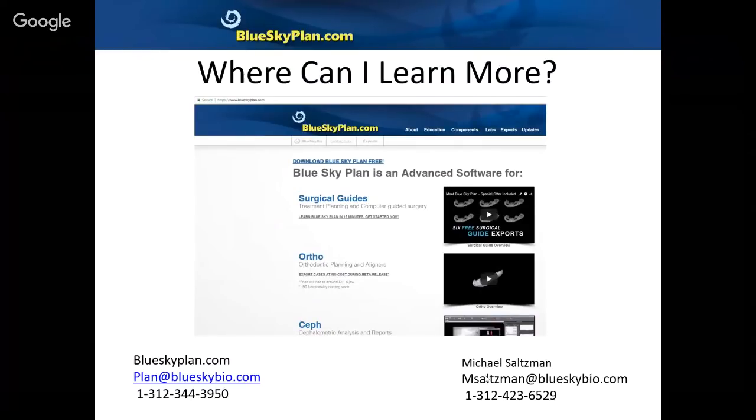We love hearing feedback. And Lab Pronto, we've gotten a lot of great feedback from users that have been using it. We're building that out as well, adding a lot more functionality to improve turnaround time, delivery options, a backend for doctors to see which cases are in the pipeline, where they stand in the pipeline, what's been completed already. So Lab Pronto has a lot of capabilities, and we're continuing to improve that functionality as well.